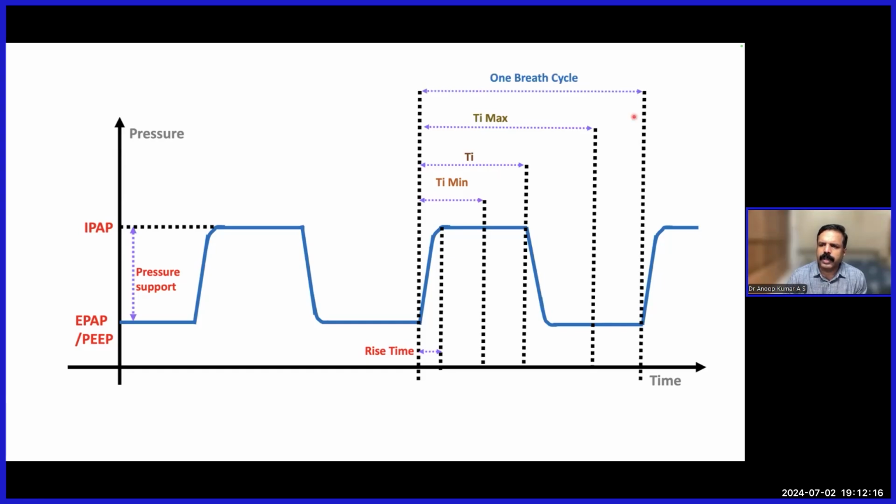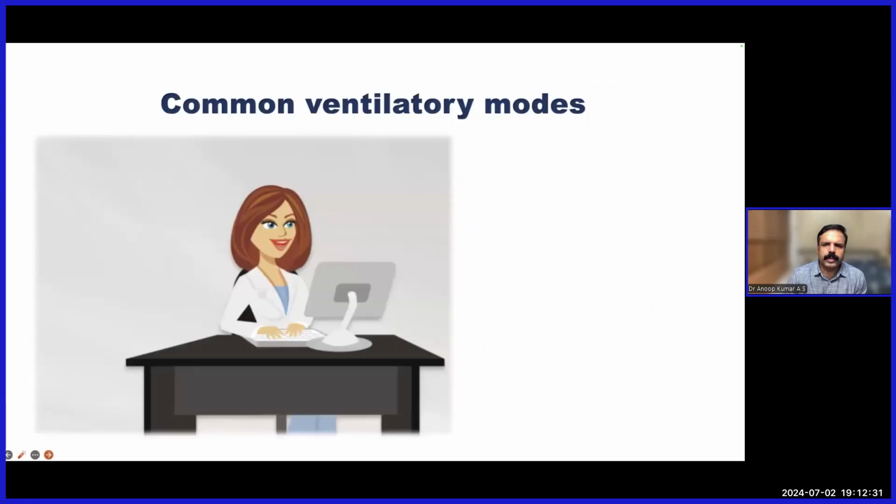Then you have the next component, which is the one breath cycle. That is, the inspiration and the expiration together are called the one breath cycle. Inspiration plus expiration. Okay.